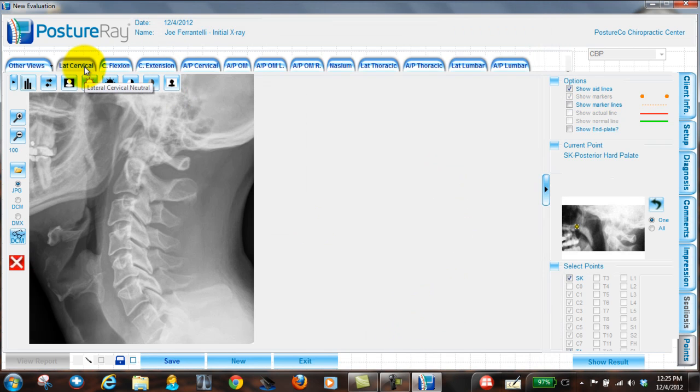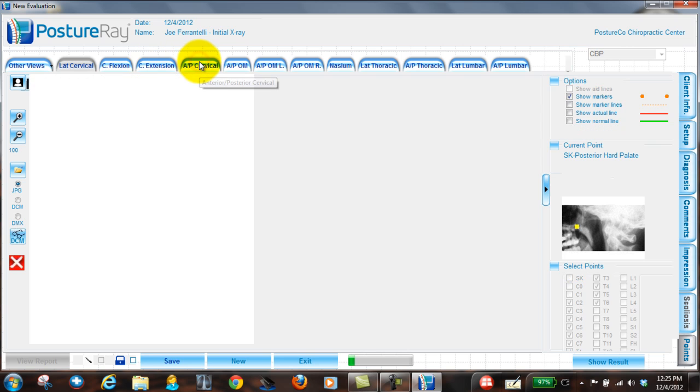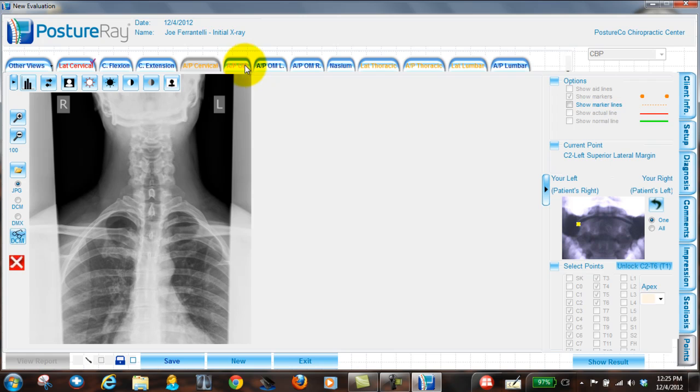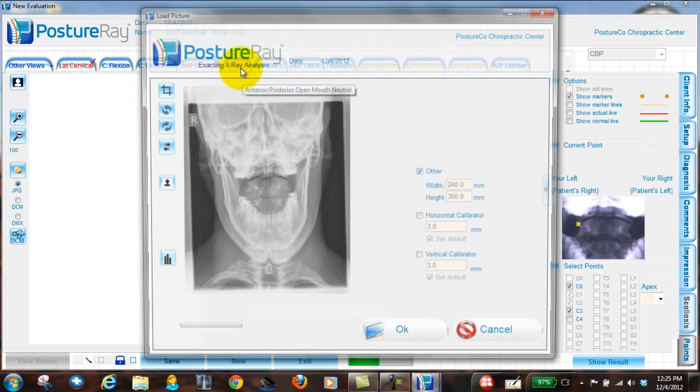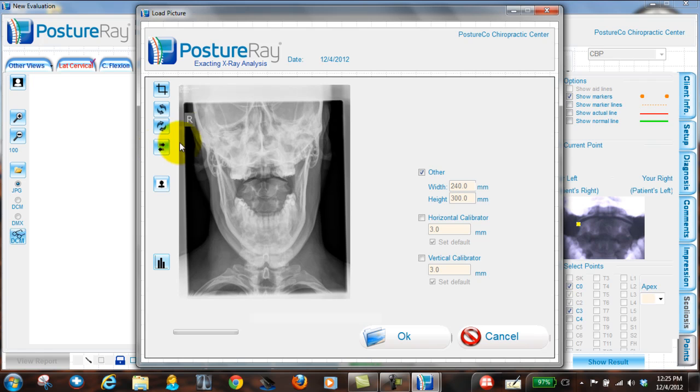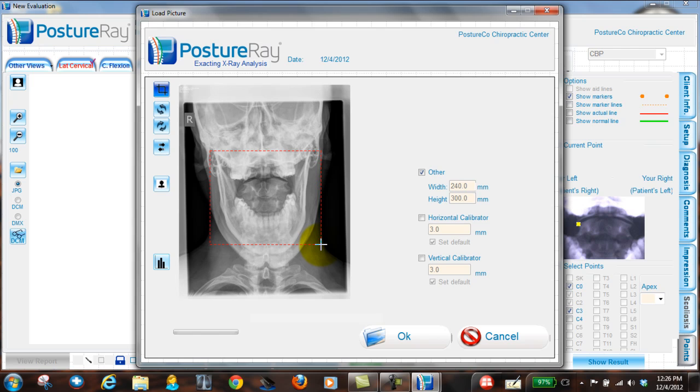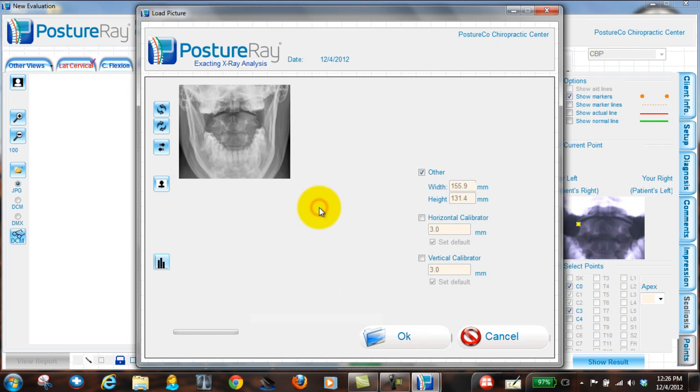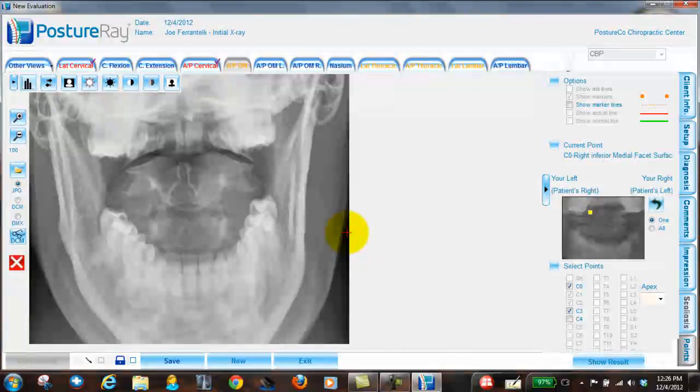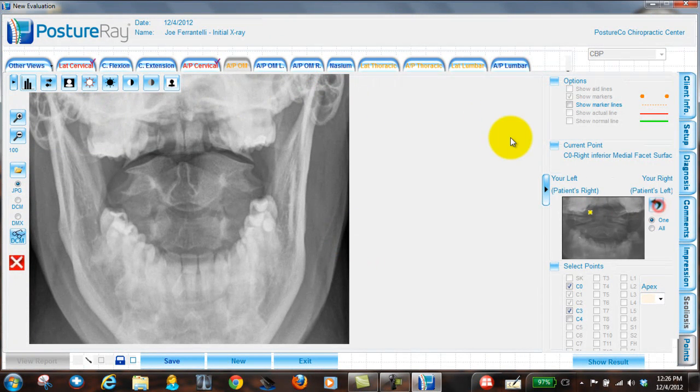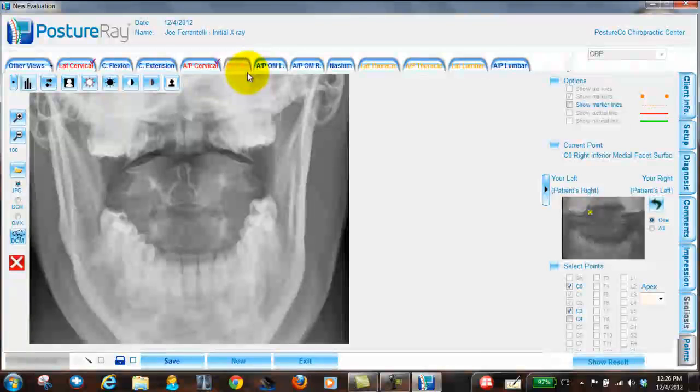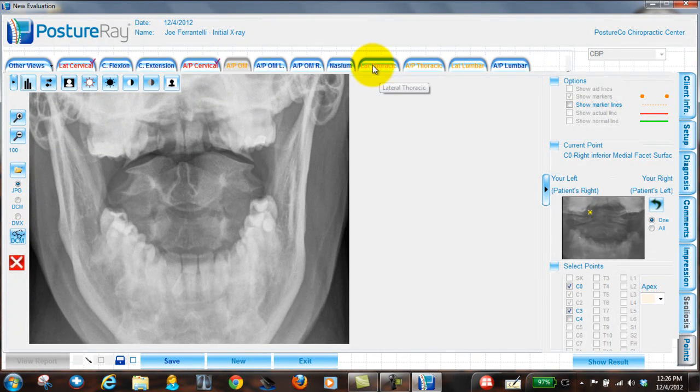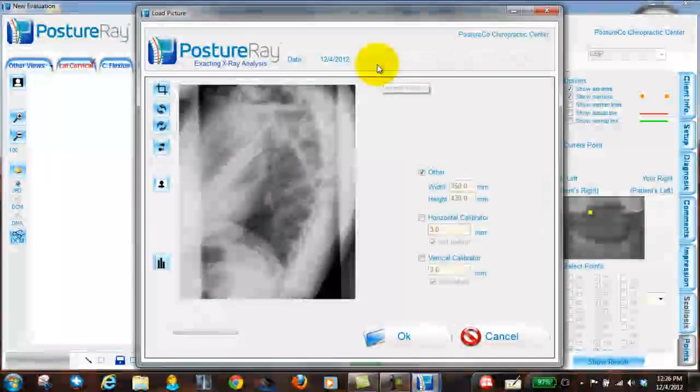And then what I would do is we could go in and I could go ahead and hit AP cervical. Hit yes. And then I can hit APOM. Notice I could crop this down still. And always pay attention. Is that on the correct side? If it's not, you can flip the tool. I'm going to crop this down to more of an APOM so it appears larger for digitization. That's up to you. It's clinical on what you want to do.